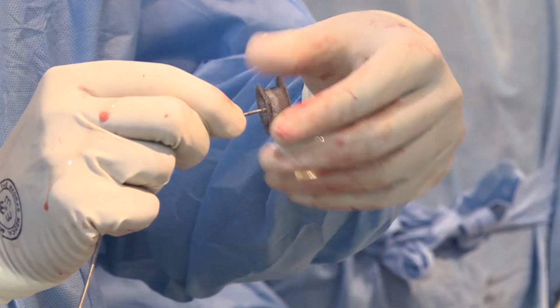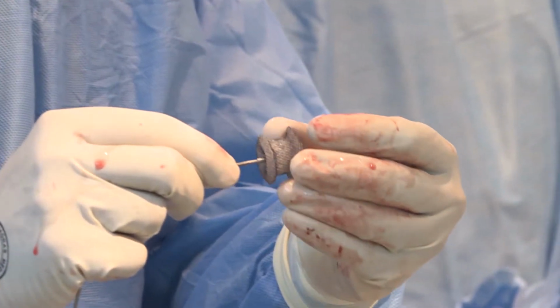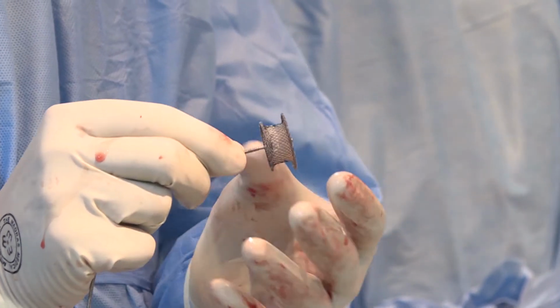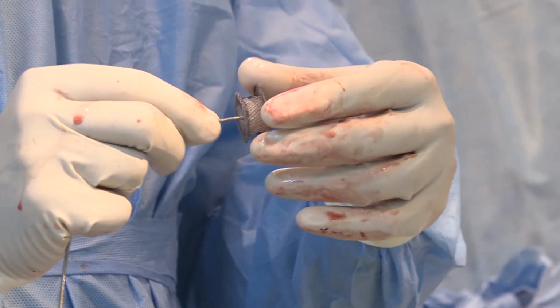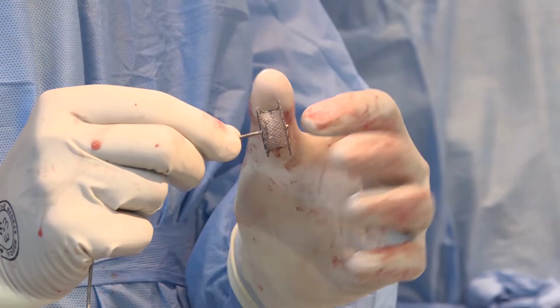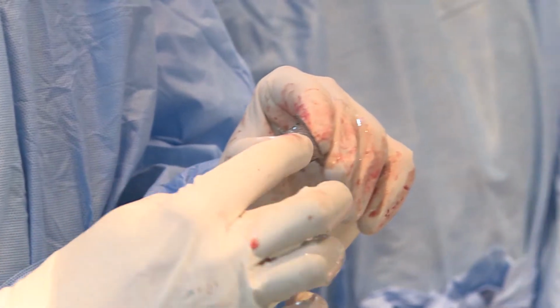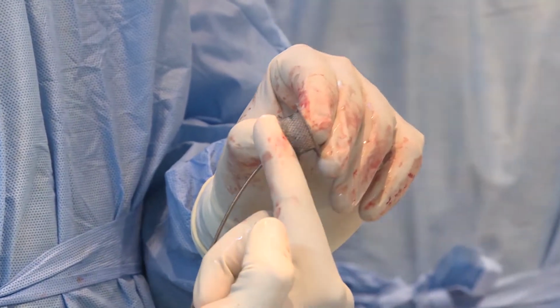Okay. It is almost as stiff as an Amplatzer muscular VSD device. It is not soft like a post-MI VSD device. The post-MI VSD device is made of thinner nitinol wires, so that is a little bit softer. This is more like an 18 millimeter Amplatzer muscular VSD device. However, the advantage is, while an Amplatzer 18 will have a 4 millimeter flange on either side, this is 5 and 3. It's higher on the aortic side and lower on the PA side.